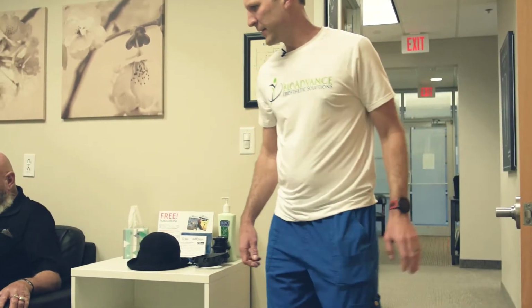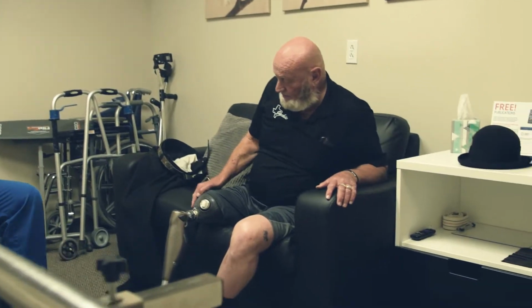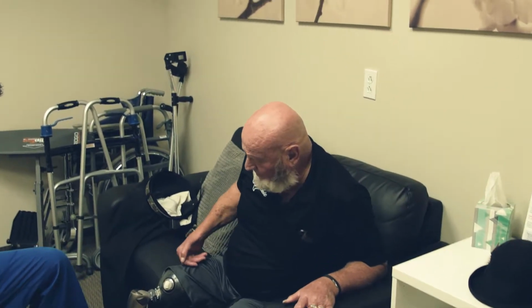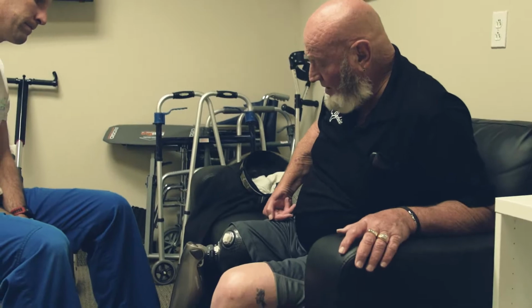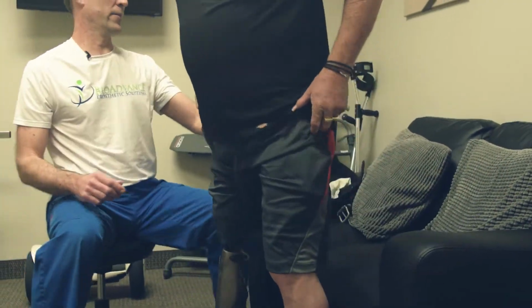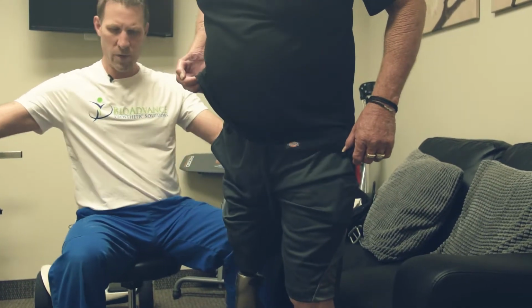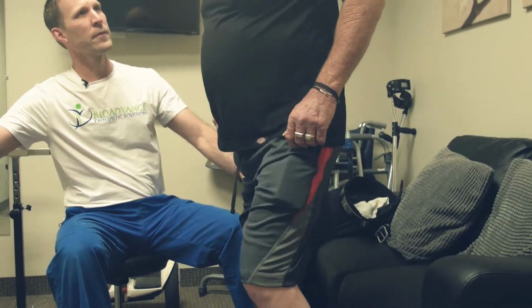Hey, Jackie, are you ready for me? Absolutely, I'm ready. So tell me what's going on with you. I think this thing's in pretty good shape right now, really. I did recently change the liner out because that liner I had in it was about worn out. But aside from that, I think it's in pretty good shape. Let's take a look at everything and see how it's fitting. You know, this is about the best leg you've ever built for me.